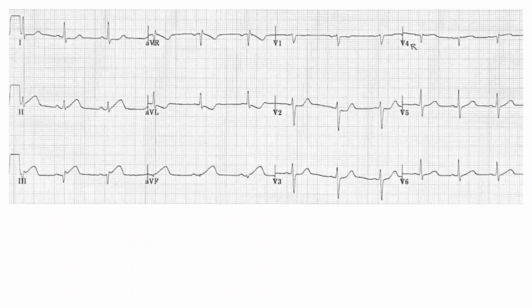I will show the ECGs. So we are focusing on inferior MI, so we have to look at lead 2, 3 and AVF. You can see in lead 2, ST elevation is not prominent. You can see a hyperacute T wave, maybe not very prominent, but in lead 3 definitely there is ST elevation. In lead AVF also there is slight ST elevation. And as I have told you, you have to see the reciprocal changes in AVL. So AVL is very important for the reciprocal changes. Definitely you can see that lead 3 ST elevation is more than lead 2. So here the culprit artery is again RCA. Also you can appreciate that there is a Q wave in lead 3.